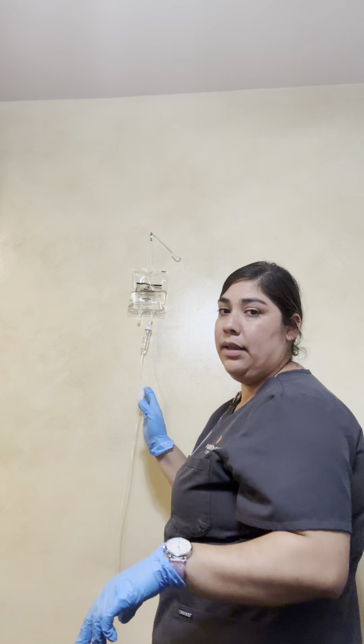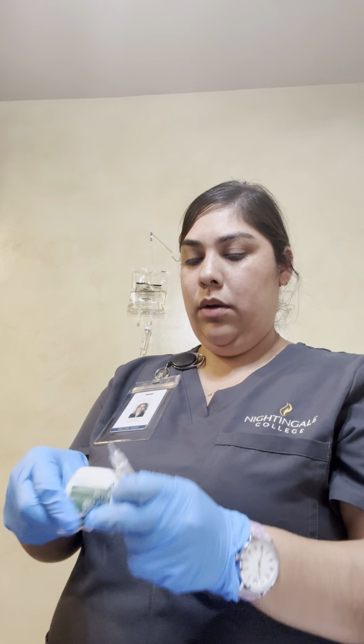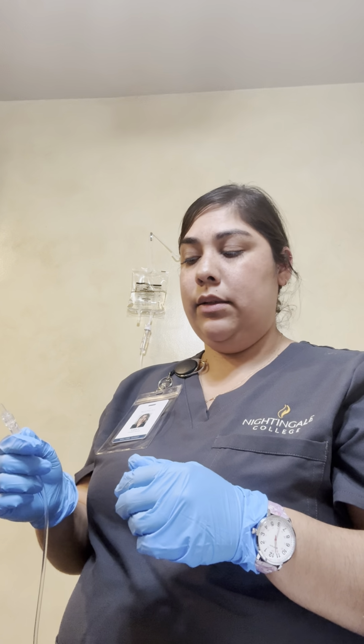Now that we verified that that was 38 drops for that full minute, we are now going to connect. And before we connect, we will wipe this with an alcohol swab, and we would let it dry before we connect. It's dry, we would go ahead and connect. And so now, I'm gonna leave that off to the side.